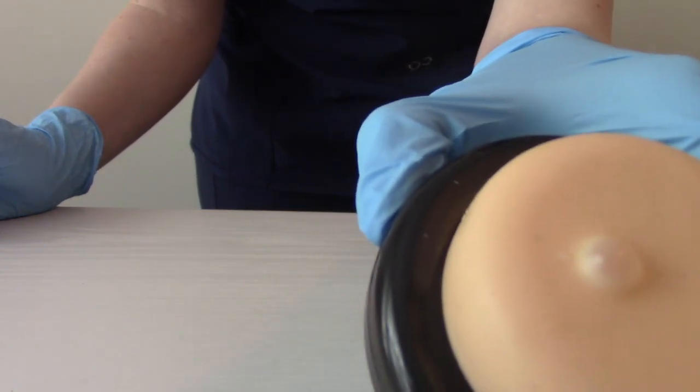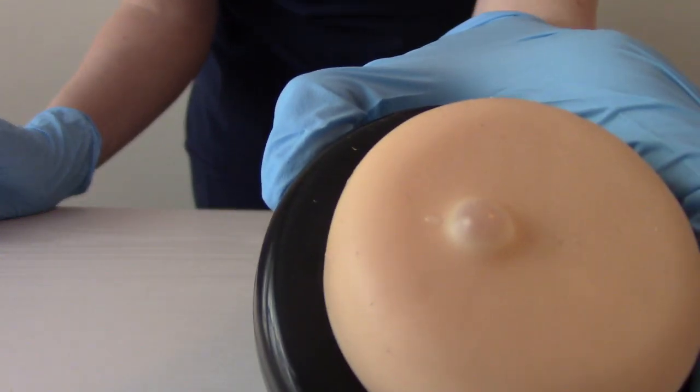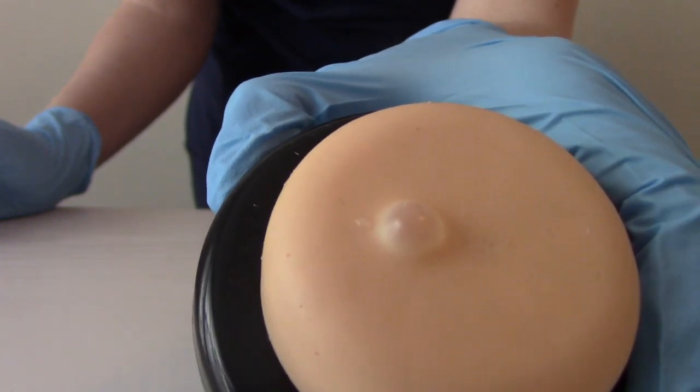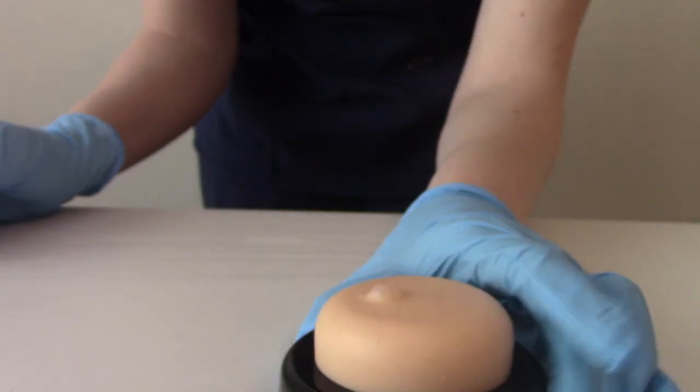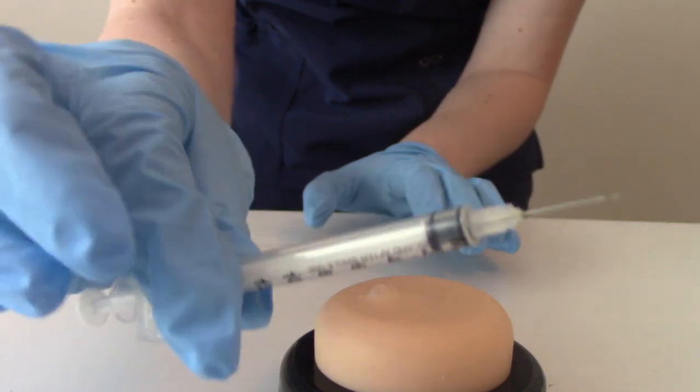There we go. So we have a little bleb and this needs to be read within 48 to 72 hours. And then of course, we're going to dispose of this in the sharps.